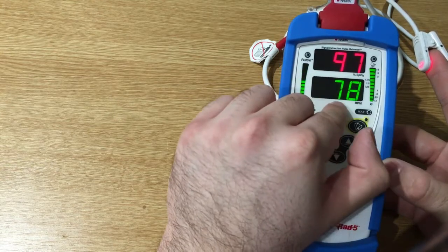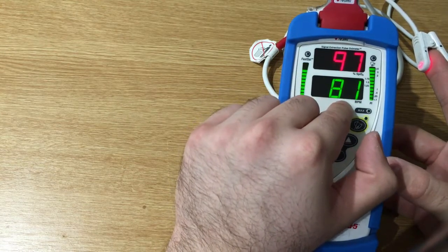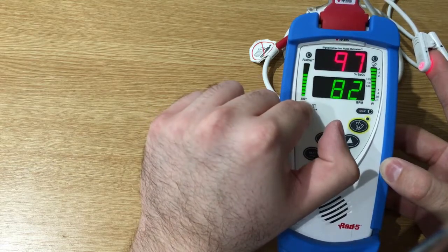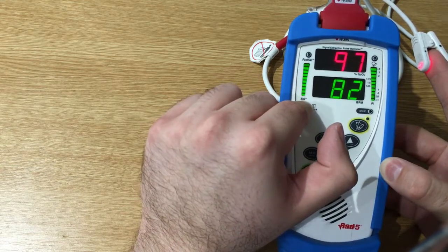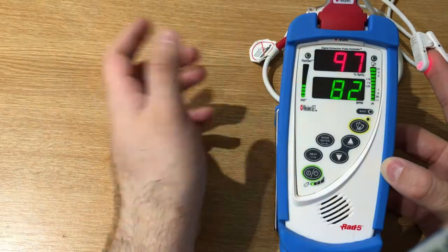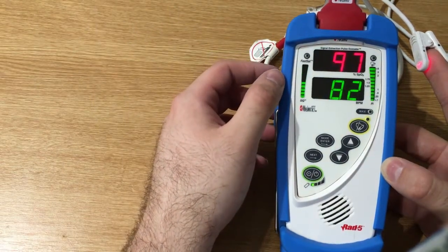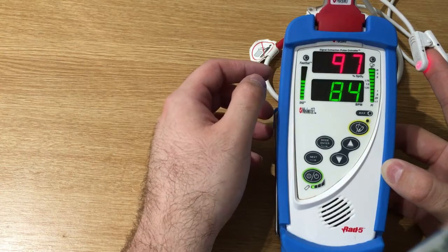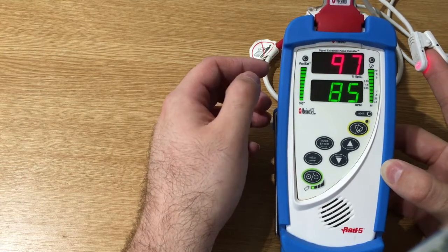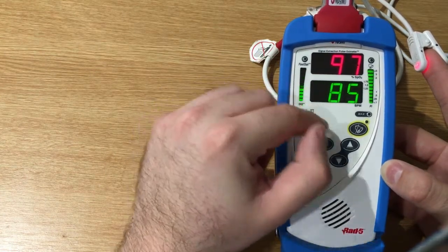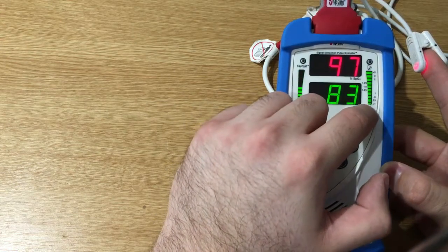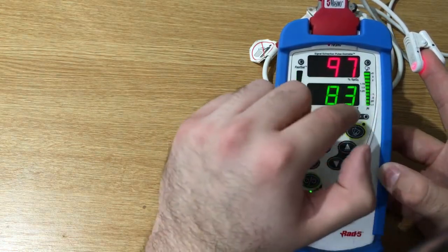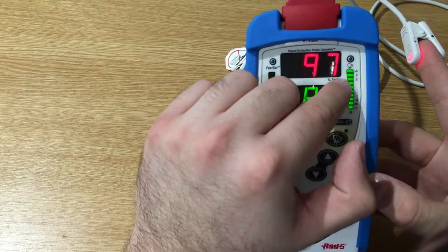It's pretty quick to pick up a reading. As you can see, the top display is for the SP02, the bottom one is for the heart rate. Here we have the signal IQ indicator. So when the signal is very low and SP02 and pulse rate values are not very accurate, the LED turns red. Here we have the pulse index indicator, and as you can see there are the values on the side.